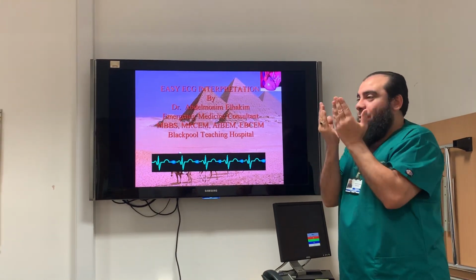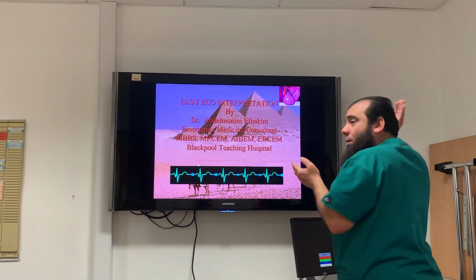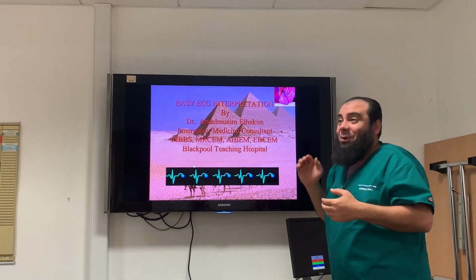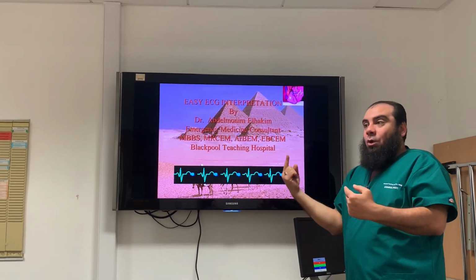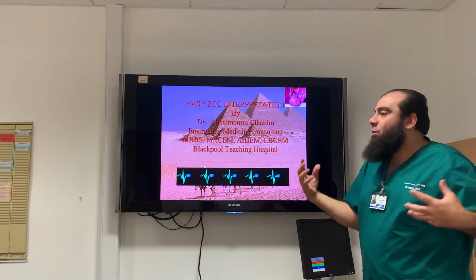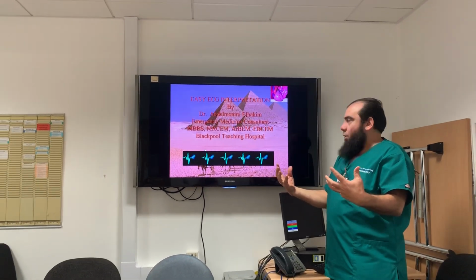They can also look at the back. But the heart has a back too, so we need to record it if possible. To get all the way around the heart, we need to take pictures from all possible directions to get a clearer vision of what is going on. Have you got it? Okay.